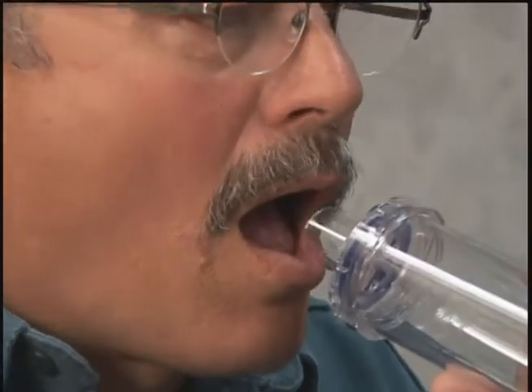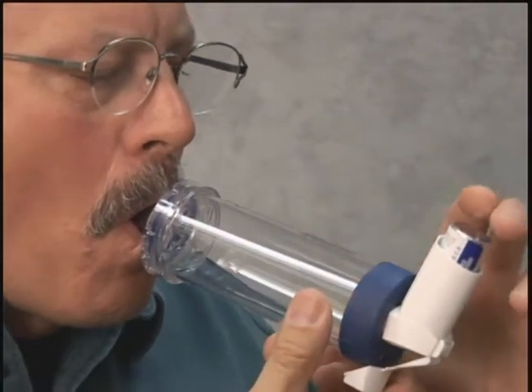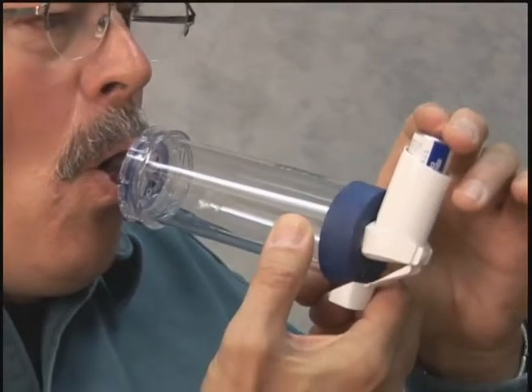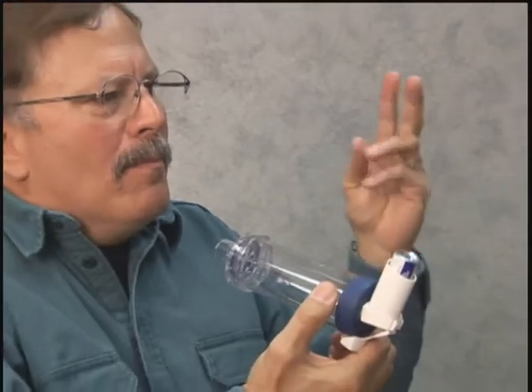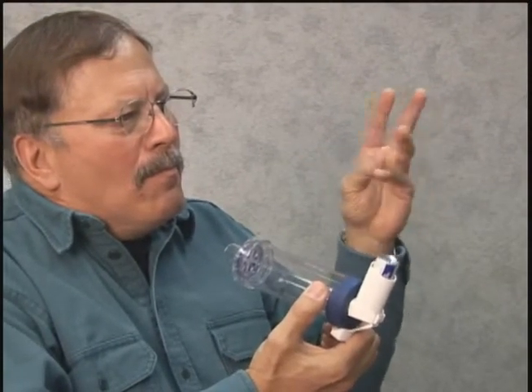First, breathe out. Then put the mouthpiece into your mouth. Place it over your tongue and close your lips around it. Press down on the inhaler to put one puff of medicine into the holding chamber. Then breathe in slowly and deeply. Hold your breath as you count to 10, then breathe out.